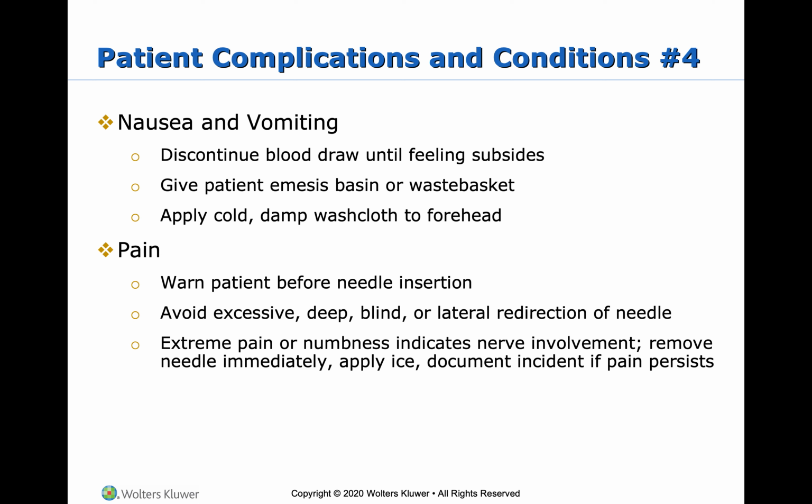I can pull my needle back, move my arm a little bit, and redirect the needle into the vein. Then you are welcome to redirect your needle. But you will never blindly probe or fish around. If you cannot feel where you are in association to the vein, you will not redirect your needle, because that's not redirection, that's just probing. If you can feel and move your needle into the vein, that's a redirection. If you are blindly probing around in the skin, that is not a redirection.